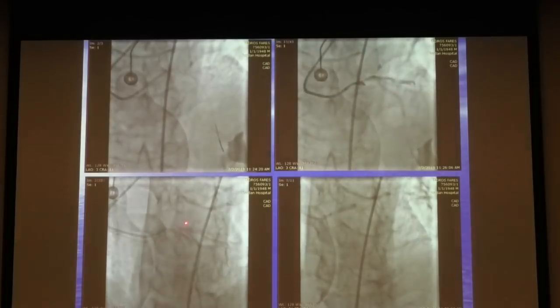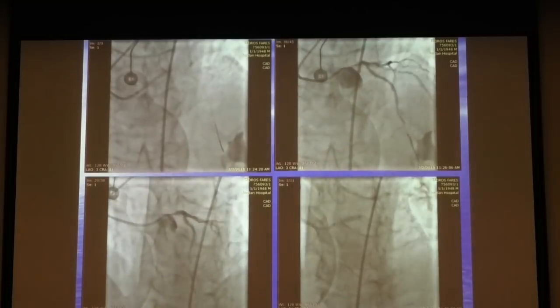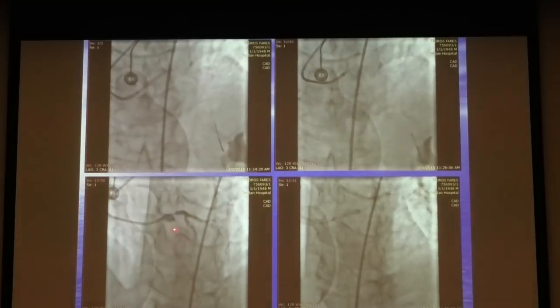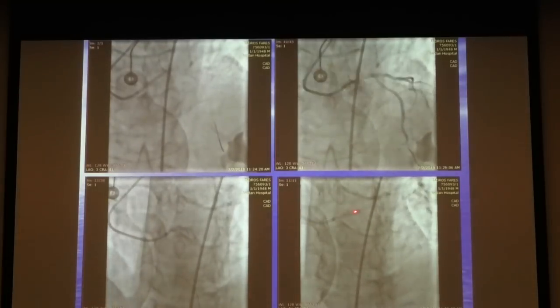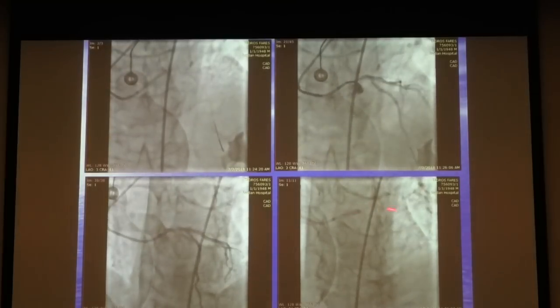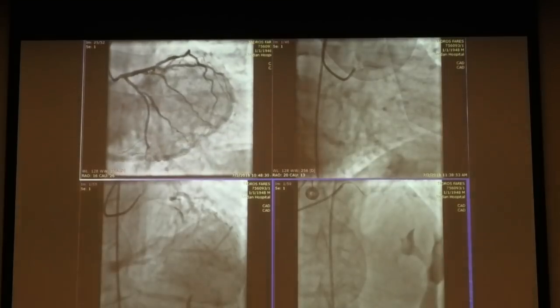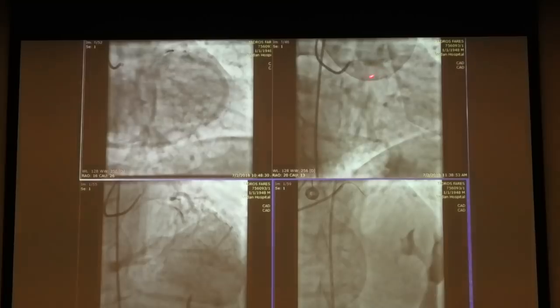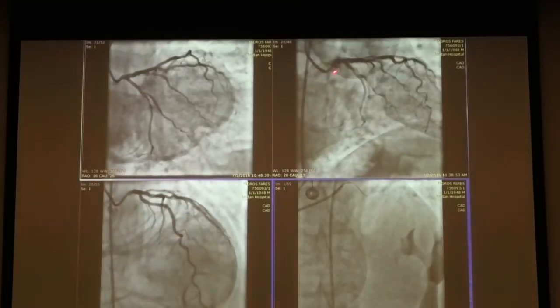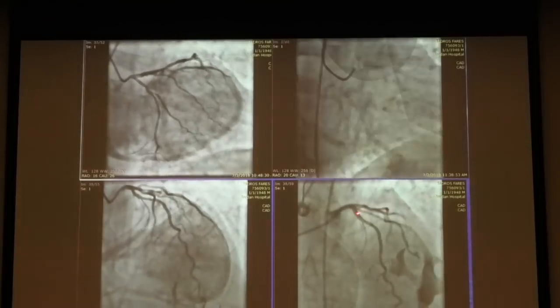So this is what we did, stent implantation, POT technique using a large balloon here into the left main, avoiding crossing into the carina. And this is before, and this is after, wide left main into the LAD. The left circumflex was not compromised. There's no stenosis, so we did not even touch it. We did not even rewire it. So here the blush and the venous flow is not compromised. It is completely normal.